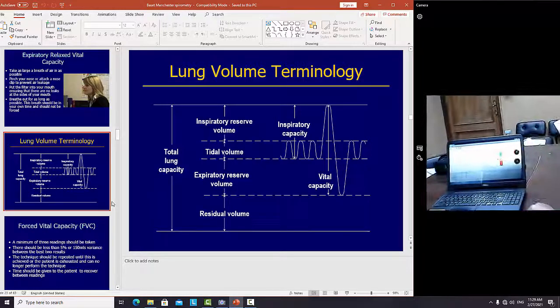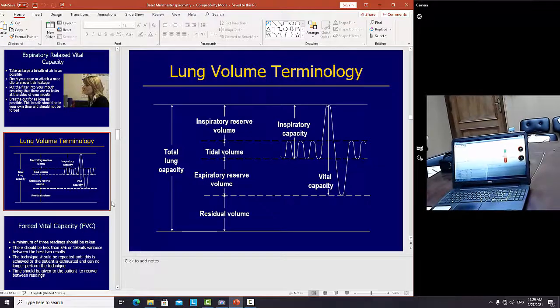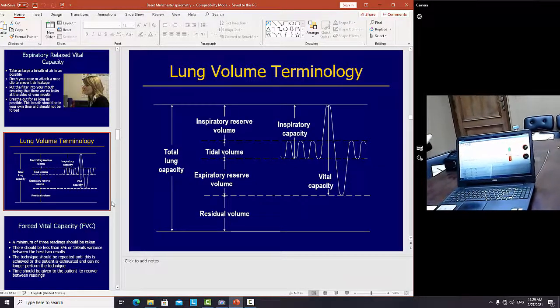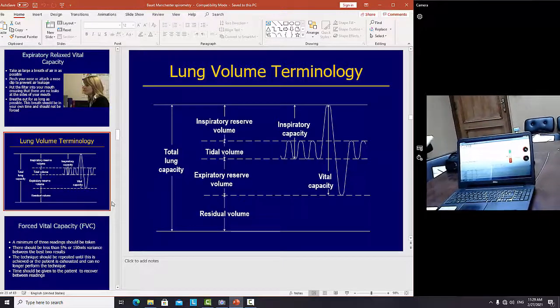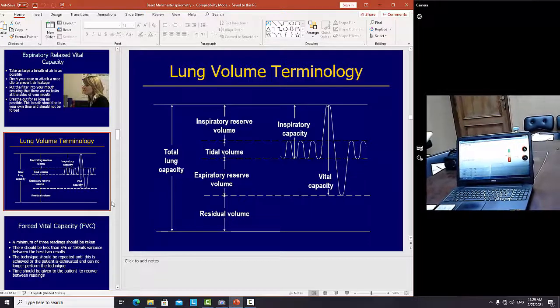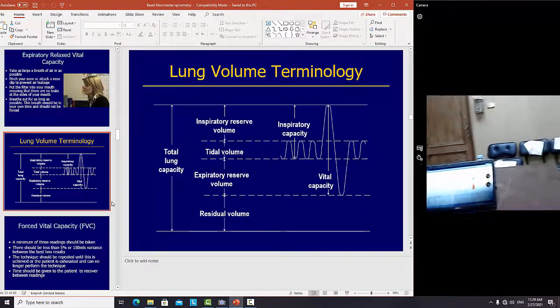The patient during the slow vital capacity maneuver. Where is the slow vital capacity maneuver first? Remove this one. And when we start by this slide, when we start, Mr. Hassan, again.